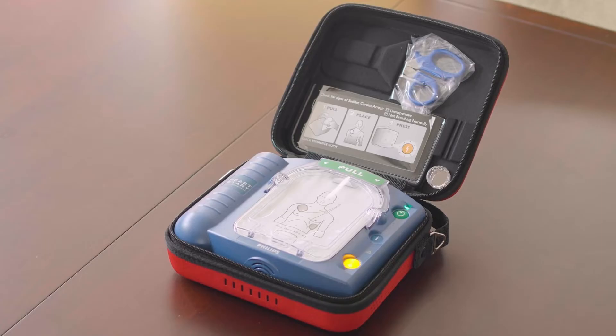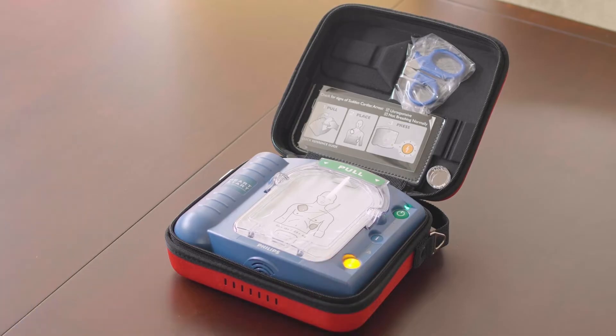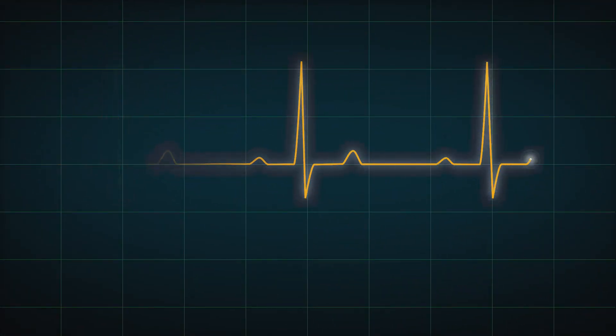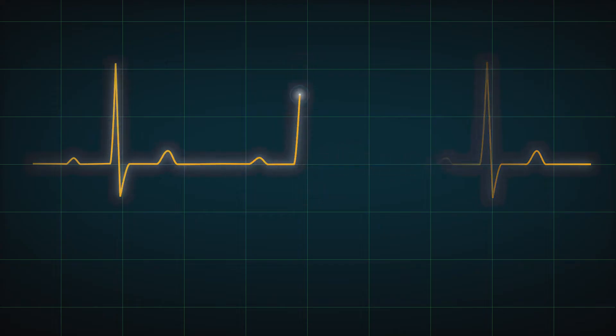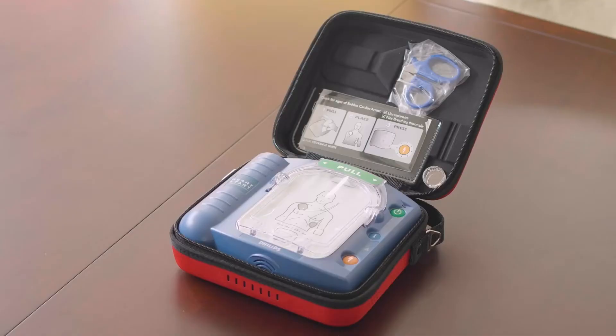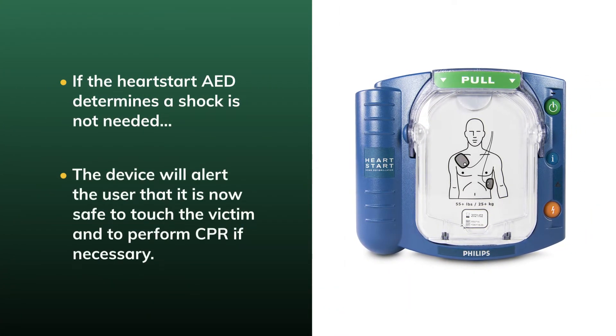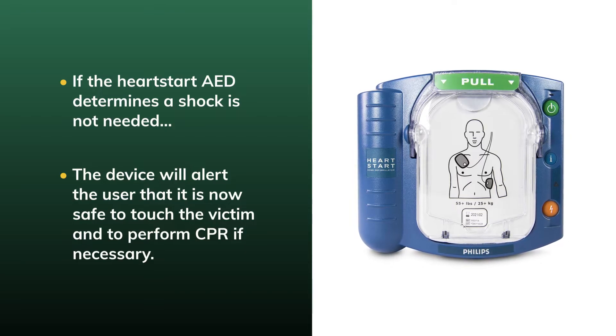If a shock is required, the device will instruct you to press the flashing orange shock button. Before pressing the shock button, make sure nobody is touching the victim. After pressing the shock button, the device will confirm that a shock has been applied and that it is once again safe to touch the victim. The HeartStart Home AED will then analyze the heart rhythm once more and determine if CPR should be administered. If CPR instruction is needed, the user can press the flashing blue I button to receive coaching. If the HeartStart Home AED determines a shock is not needed, the device will alert the user that it is safe to touch the victim and begin CPR if necessary.